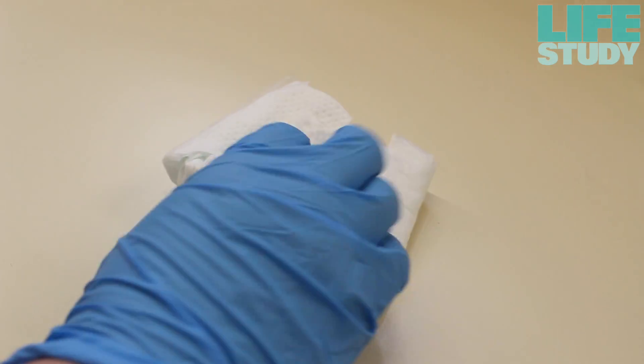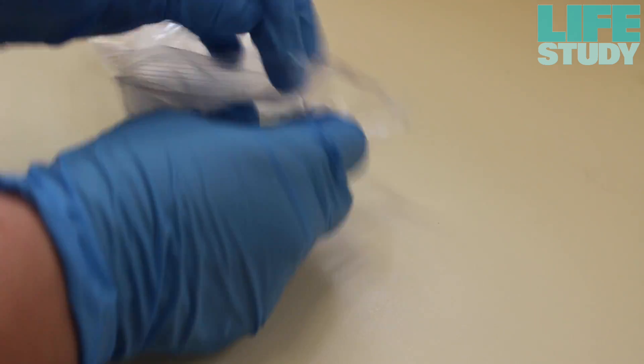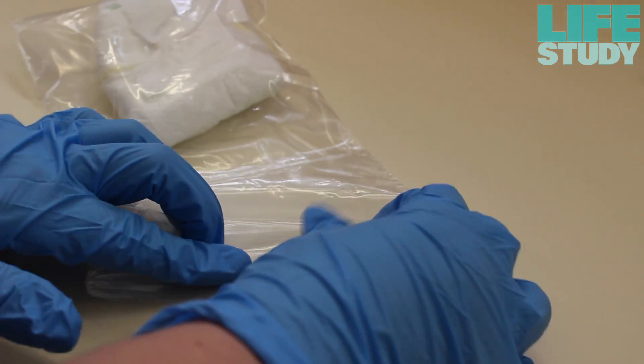Once urine has been passed, the nappy should be removed by the parents and the whole nappy placed into one of the plastic Ziploc bags provided. Parents should be advised to hand the Ziploc bag to their midwife or healthcare assistant.